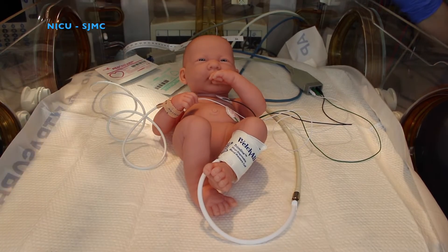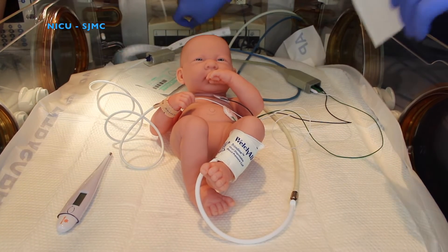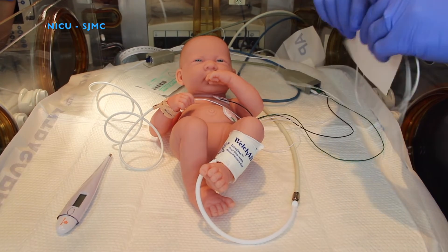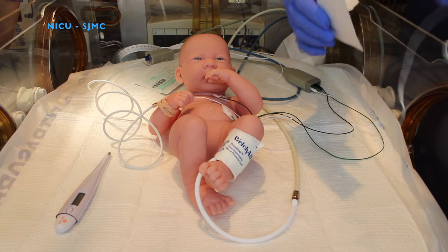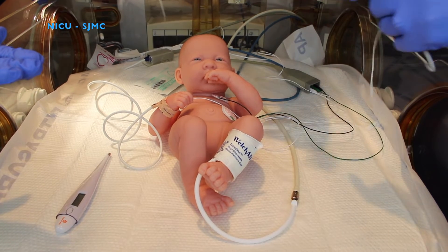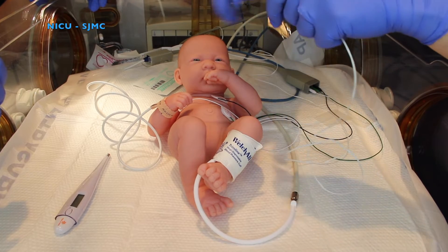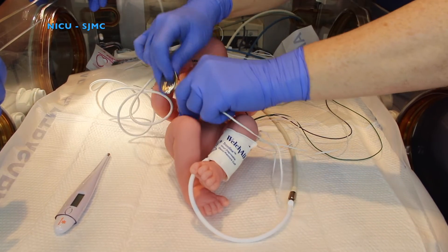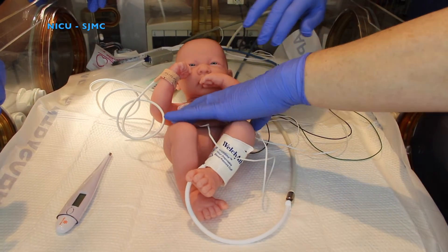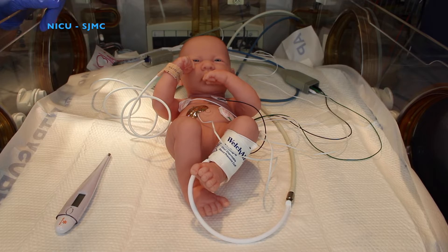Temperature reads 98.2. Next, you're going to secure the skin temperature probe to your baby. This will communicate to the bed what the temperature of the baby is, and it will either heat up the bed to keep the baby warm or decrease the temperature if the baby is too warm. Once you have the skin temperature probe secured, you go to your giraffe bed to select the temperature setting for your baby.